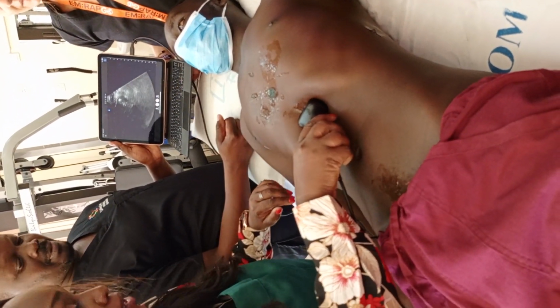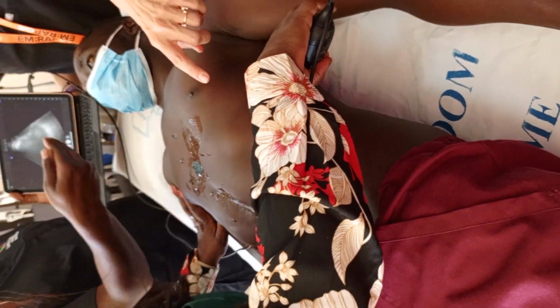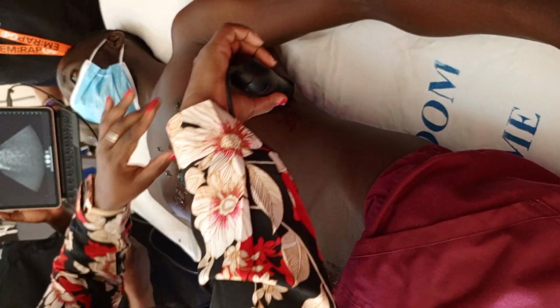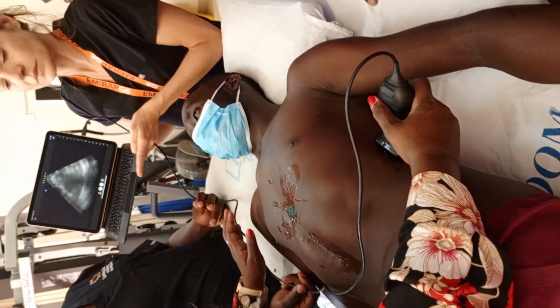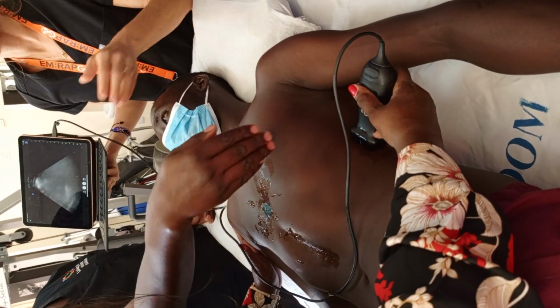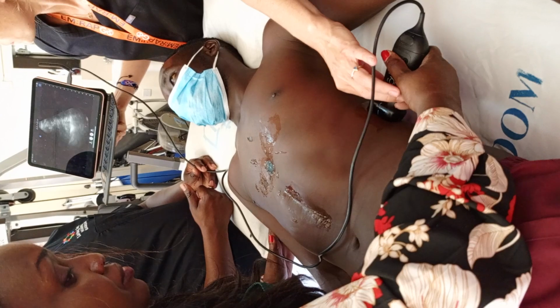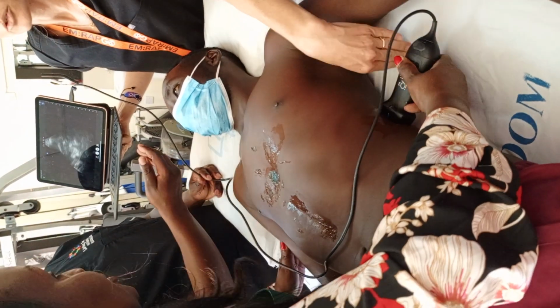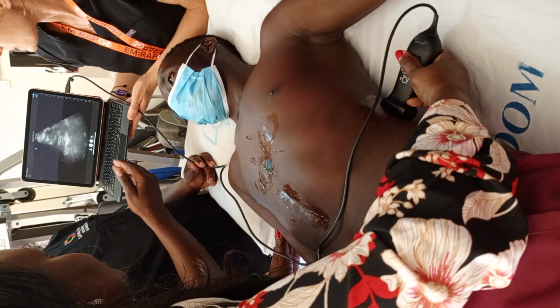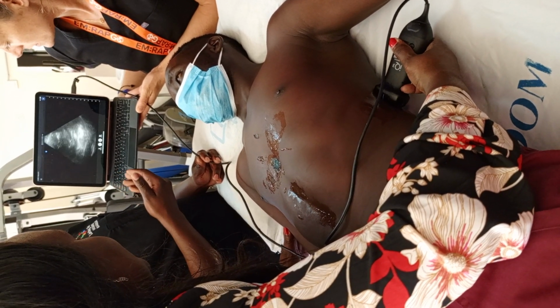Yep, gorgeous. And then left upper quadrant. Now remember, always look where the indicator is. Where do you want the indicator? Beautiful. So remember on this side, sorry, I'm going to move your arm out this way. It's more down towards the bed and up towards his head. And that rhymes, and I feel very proud of myself.